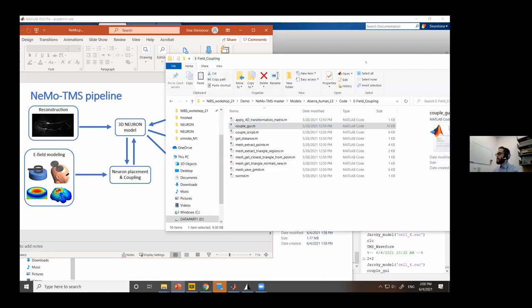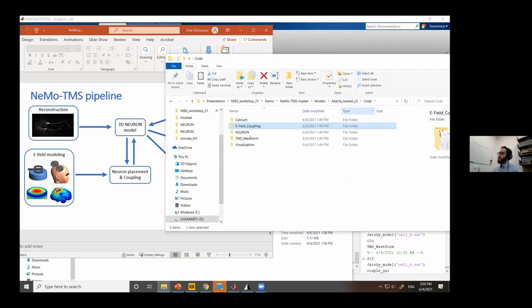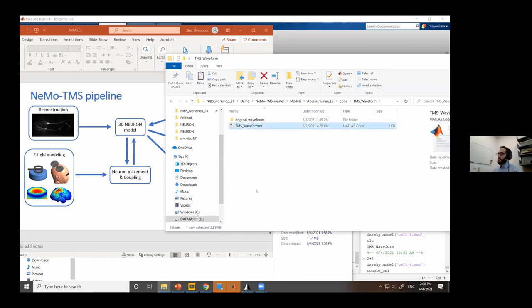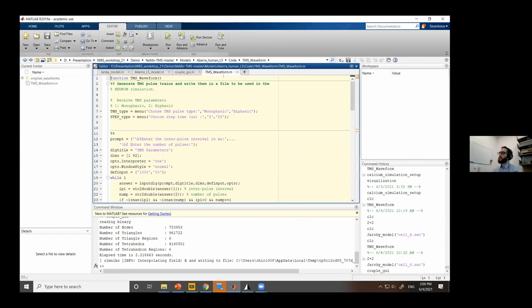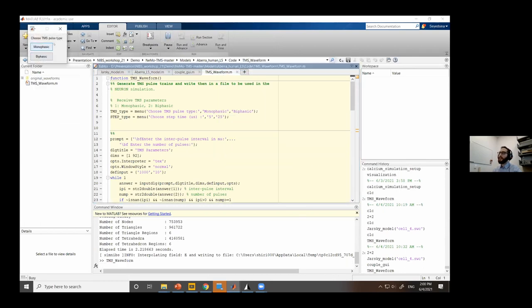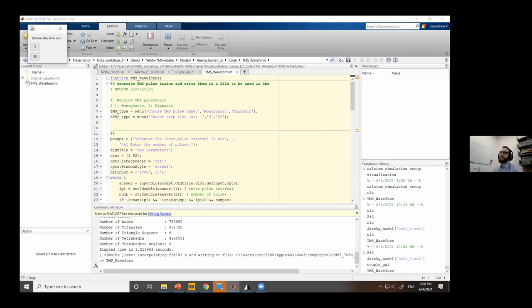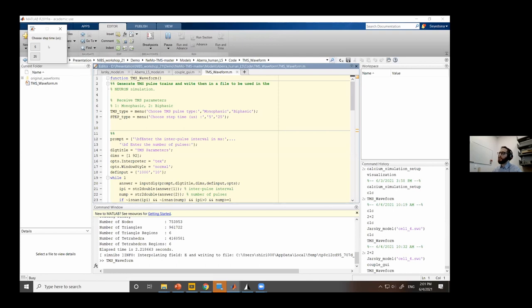To generate the TMS waveform, go to code > TMS_waveform and run the MATLAB function there. It asks what kind of TMS pulse you want — monophasic or biphasic; biphasic is more common, so I'll choose that. Then it asks for the time step: 5 microseconds gives higher accuracy but higher computational cost, while 25 microseconds is accurate enough and faster, which I recommend for most cases. Finally, specify the number of pulses and the inter-pulse interval in milliseconds — 1000 ms equals 1 Hz rTMS.